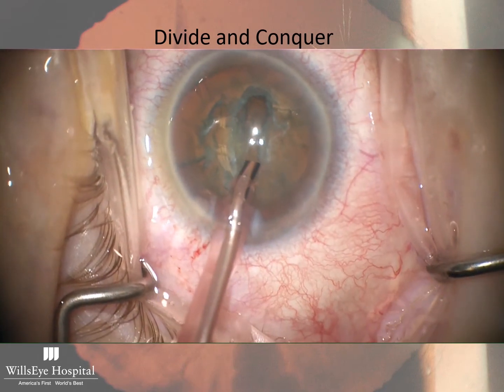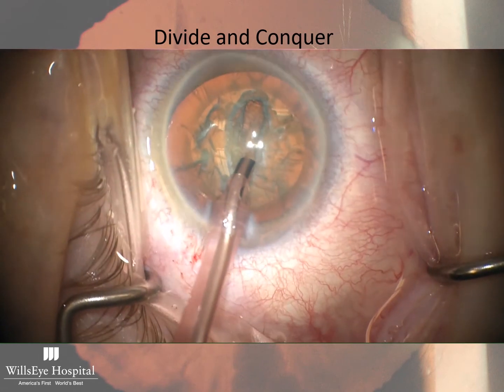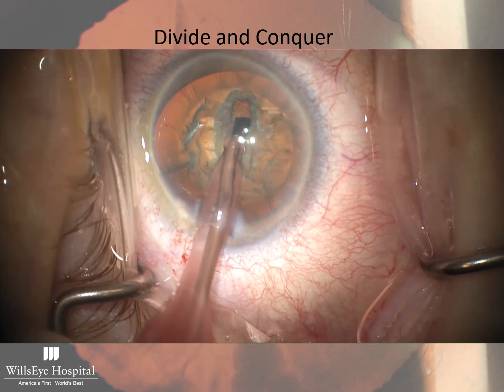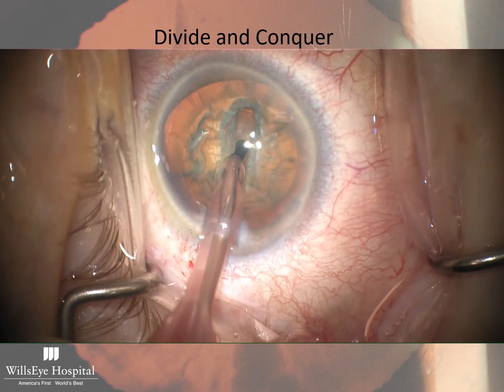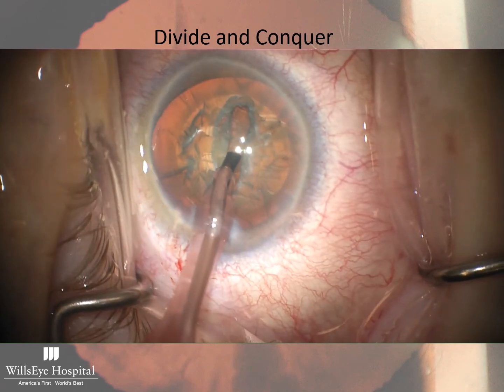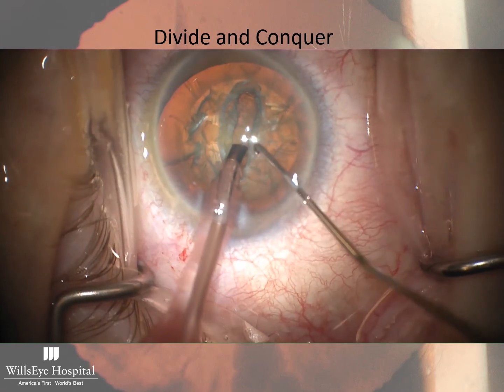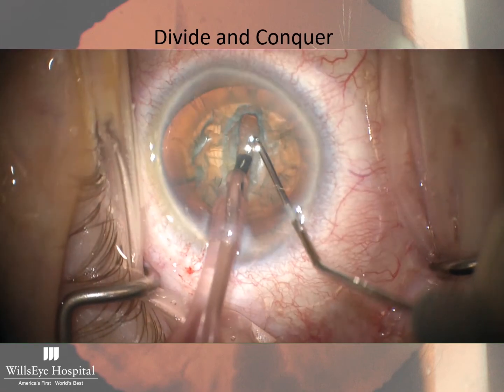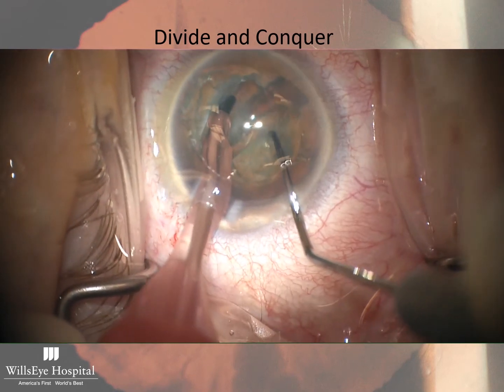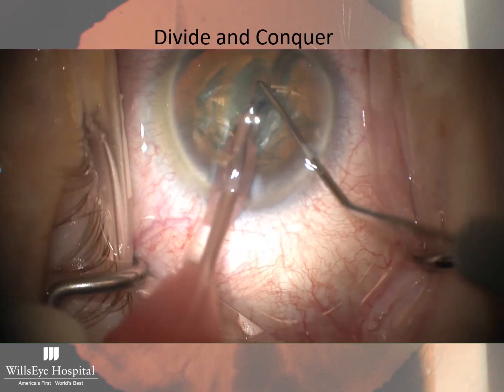So I'm trying to assess whether or not I have a deep enough groove. I actually switch my illumination here to almost full coaxial illumination, so it gives me a little bit better red reflex and better sense of where I am with the groove. I'm looking for some of the cortical sutures and chatter marks to change. And then I'm happy with where I am, so I keep my phaco tip down in the groove. Second instrument here, this is a Nagahara chopper going deep into the groove and spreading. I see a cleavage plane form, nice and slow pressure, and then I do a cross action spread as well.